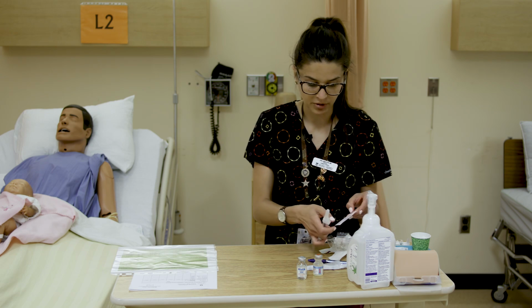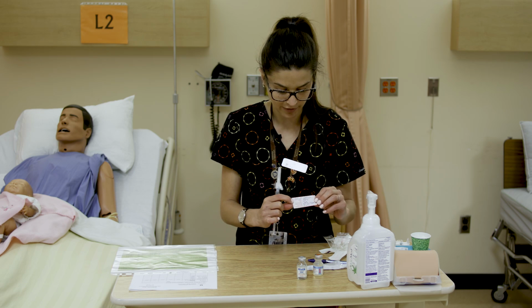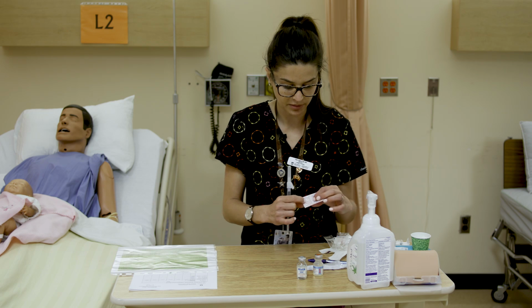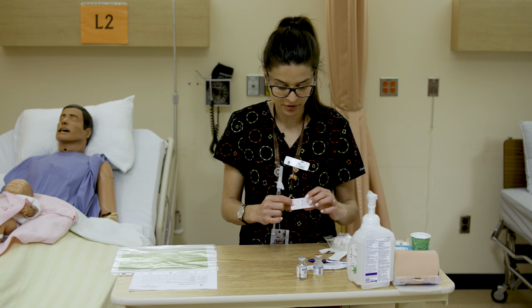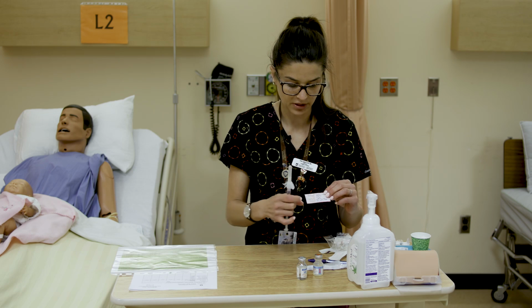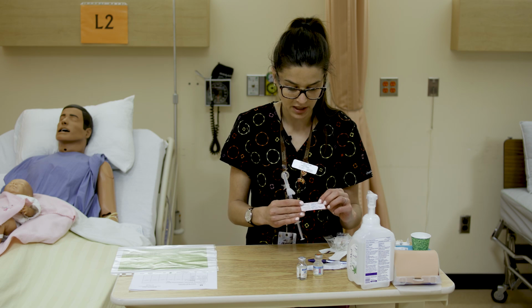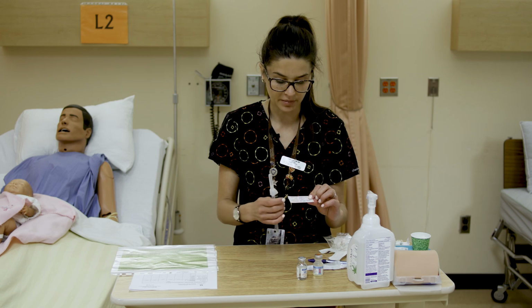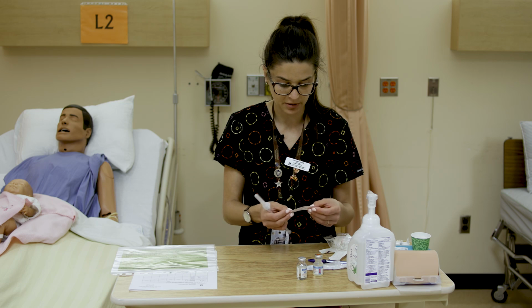So we're going to want to put the patient's name right at the top, the drug name, which is ampicillin, the dose 500 milligrams, the volume is 2 mLs. Diluent amount is going to be not applicable in this case, and you might be thinking, but we did dilute this. That's more referring to when you get into IVs and you're giving the medication diluted in something when you give it. This was to make the medication into a liquid, so it's a little bit different. We're going to write concentration per mL, because we know it's 250 milligrams per mL. That's the information we got from our monograph. And we're going to put the date, time, and our signatures.